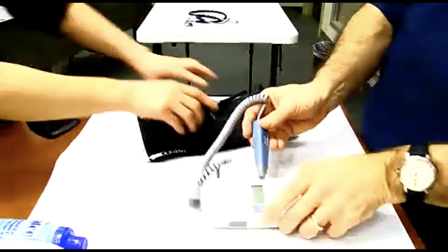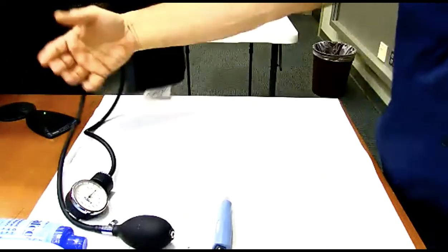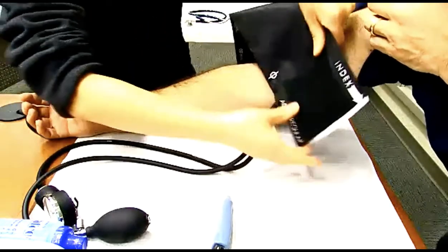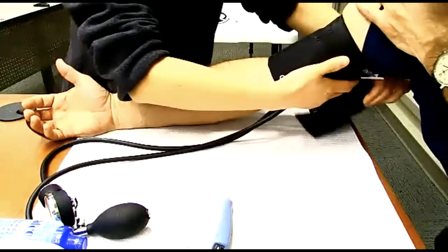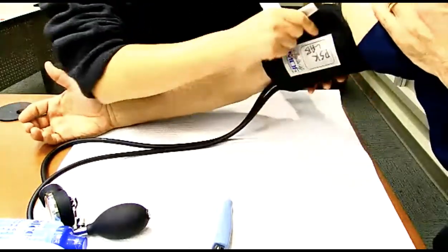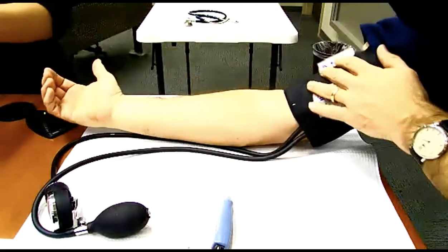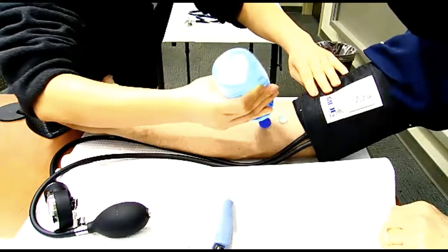This is the Doppler ultrasound with the probe that I'm going to use. And Judy is going to attach the blood pressure cuff. We'll show it in a little more detail, but she's putting that dot with the line right over the brachial artery, wrapping that around, making sure that it's there. She's then going to apply ultrasound jelly, since this is an ultrasound vascular probe, just like that.